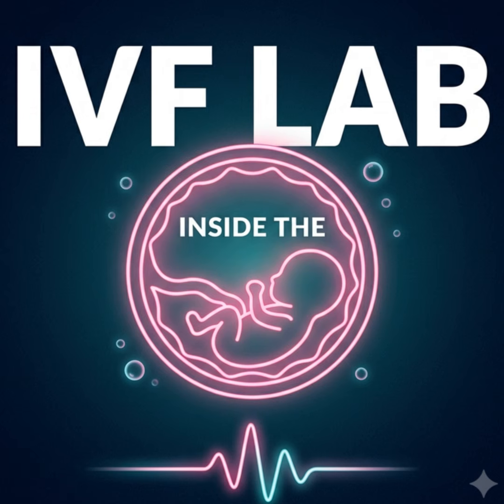It means asking a crucial question. Does an algorithm trained in one specific environment work accurately when deployed in a completely different environment? Give me an example. Let's use a detailed example. Imagine a software company develops a brilliant, highly sophisticated AI model. They train this neural network using millions of hours of time-lapse footage from a massive, highly successful clinic in Tokyo.